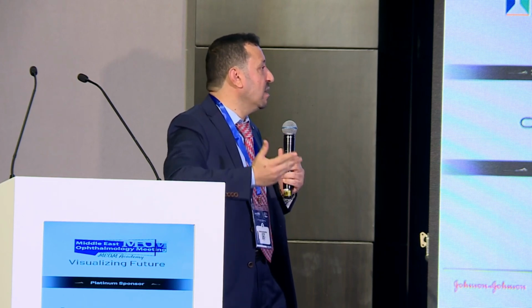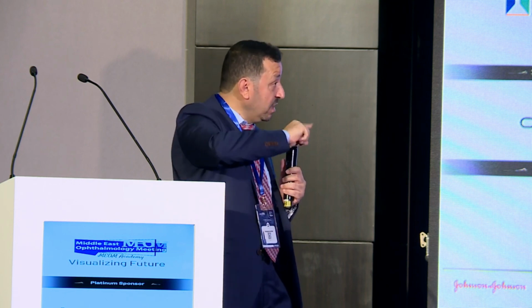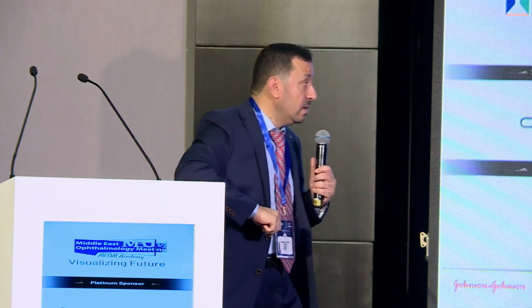So that's not a big difference, because the vision improved from 6/18 to 6/9 unaided and 6/6 aided. So I think that the topography has, of course, improved and helped a lot, but there is something at the cellular level. This is the real improvement which was achieved in this case. But you didn't measure the epithelium, for example. Sorry? There was no epithelial hyperplasia. Well, unfortunately, I don't have the epithelial mapping at that time.